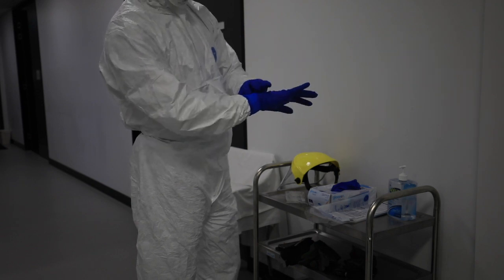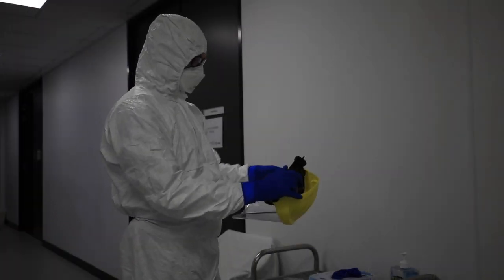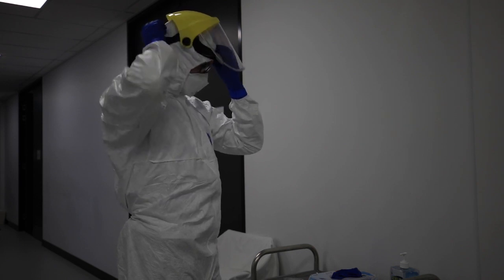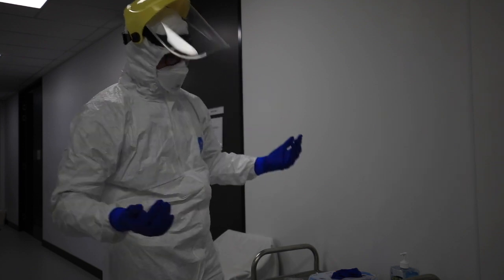Outer gloves go over the outside of the cuff — you can see it's got a nice overlap there. Now the face shield — I'm going to adjust the headband to get a comfortable fit.